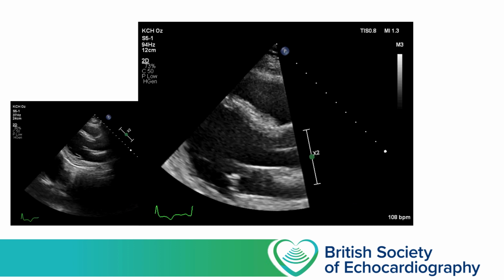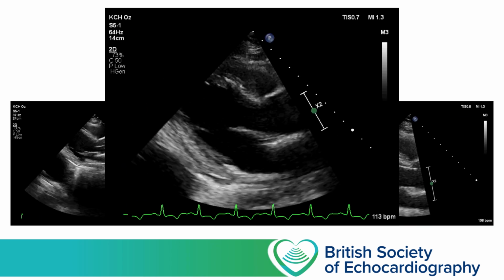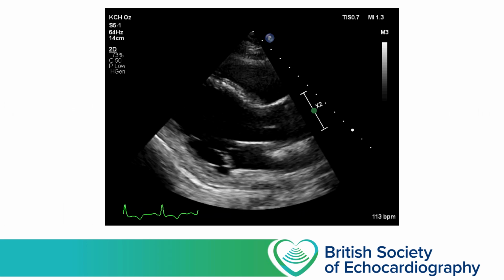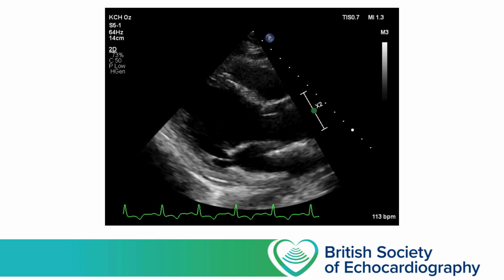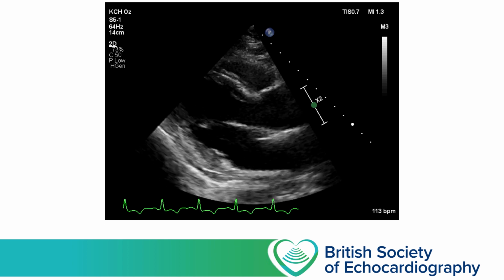This third attempt at the parasternal long axis view probably strikes the balance just right. Now all of the areas of interest are displayed, but we're not wasting any space and therefore wasting any time imaging areas that aren't useful to us. In this image our depth is set to 14 centimeters, our sector angle is probably around about 70 degrees, and we have a frame rate of 64 frames per second, with a reasonable line density producing a reasonable lateral resolution.